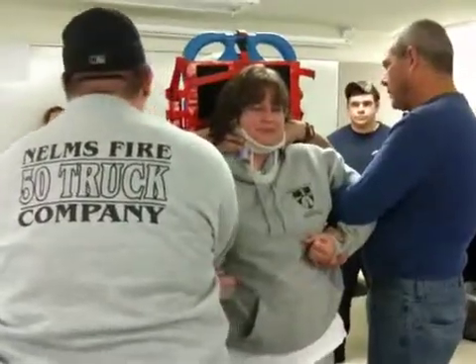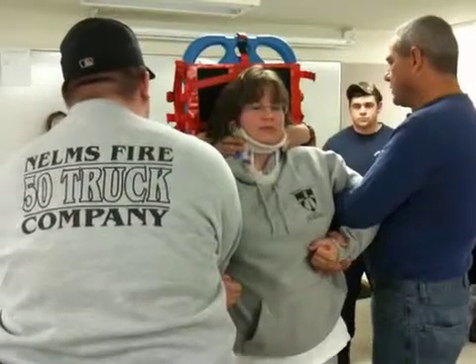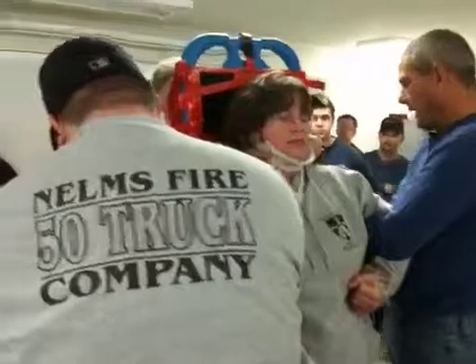All right, you're in control, right? Yes. Extend your arms completely out, just walk backwards. Extend your arms, that's the position you want to hold right there, okay? You want to keep her head in contact with the board, which it already is.